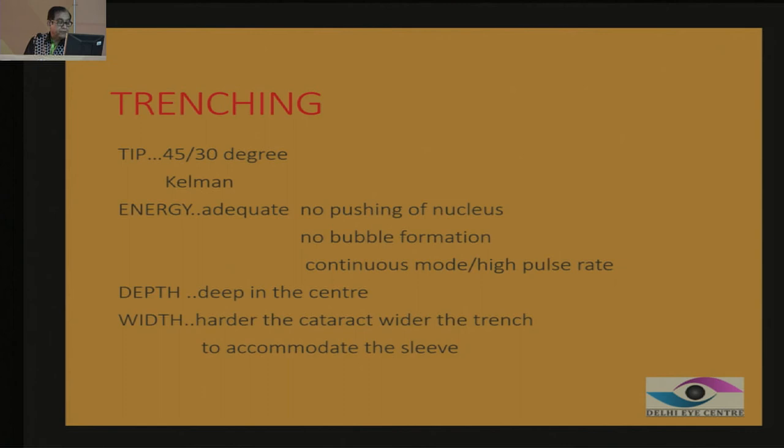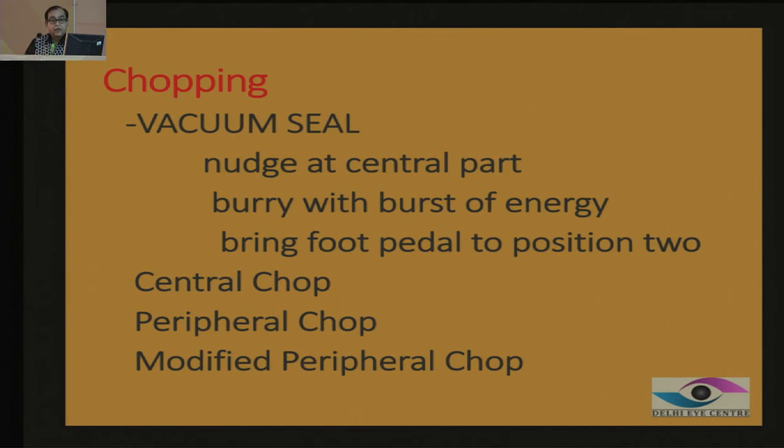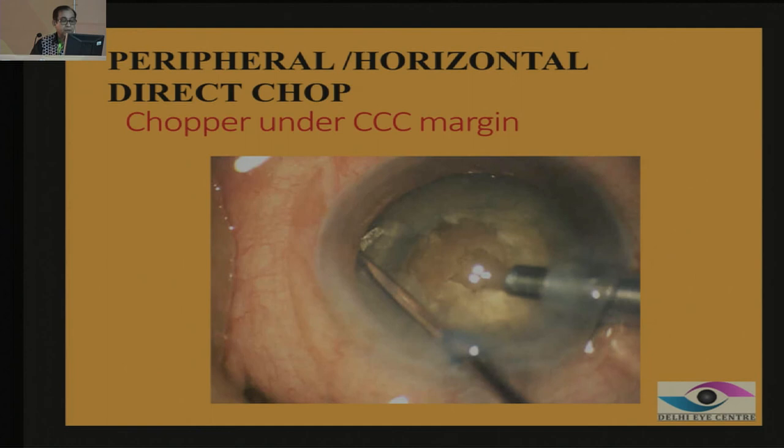We now come to the very important part called the vacuum seal. When you are trying to remove the nucleus — whether by direct chop or any other method — you first nudge the central part of the nucleus. Most of the time surgeons hold the superior part because they are scared of the posterior capsule, but the superficial superior part will not hold it well. So into the central part of the nucleus, give a burst of energy, bury the tip there, then come to mode 2 and hold it — then chop it. This is called the vacuum seal: when you bury it and hold the nucleus. You can then perform a central chop, peripheral chop, or modified chop.